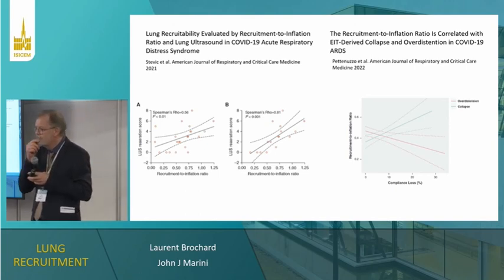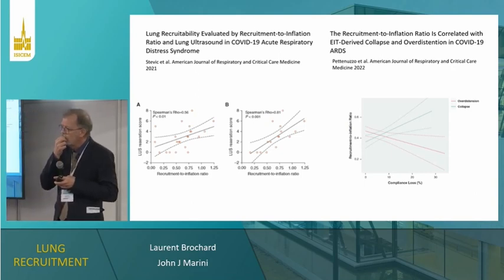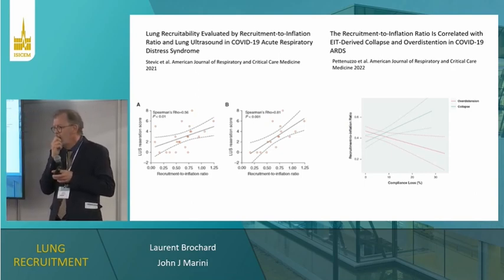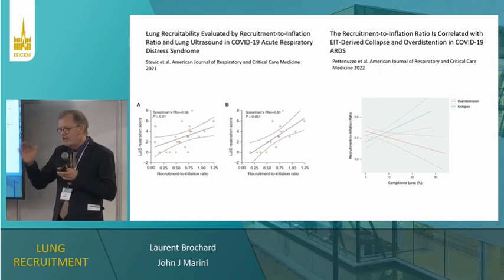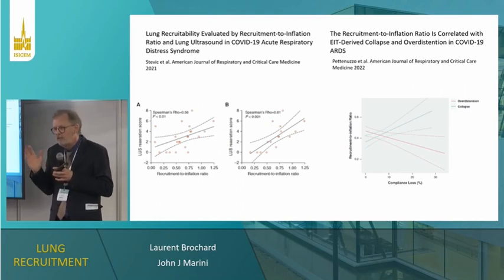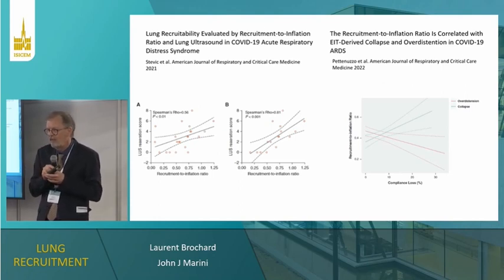Yes? And you spoke about observing driving pressure going up, potentially. So then you would use volume-controlled ventilation for these maneuvers. Yeah, we use volume control. Most of the time when we do mechanics, we use volume control because it's much easier. It's simplified. Pressure control is great, but if you think of understanding mechanics with pressure control, it's much more complicated, in fact. So that's why we use volume control, not because it makes a difference for the patient.